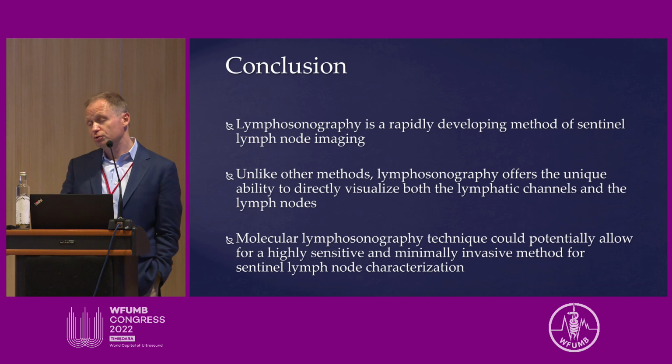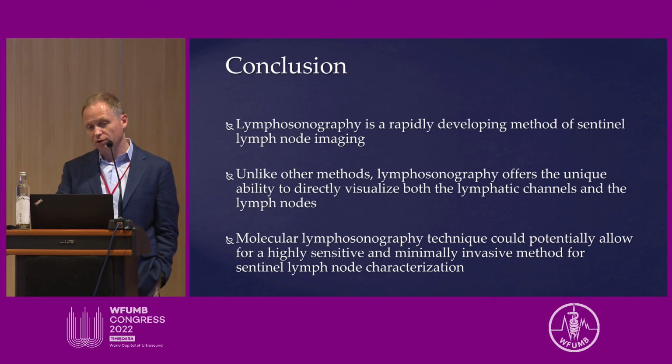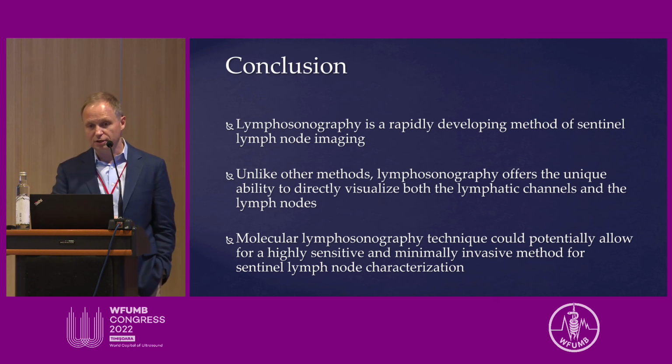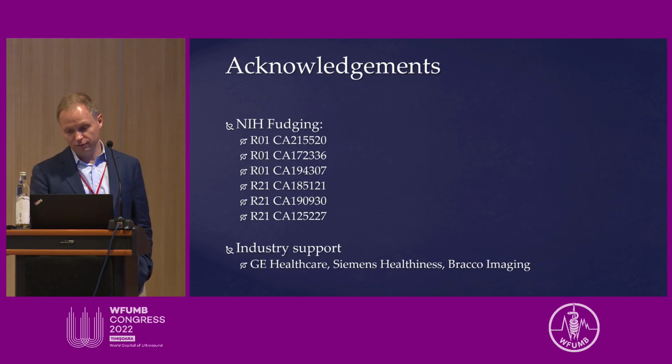If they don't want to do it, or if you're finding too many lymph nodes, we can hopefully characterize them using intravenous injection of targeted microbubbles that will go and lodge on the receptors expressed predominantly in malignant lymph nodes and not expressed in benign or reactive lymph nodes.